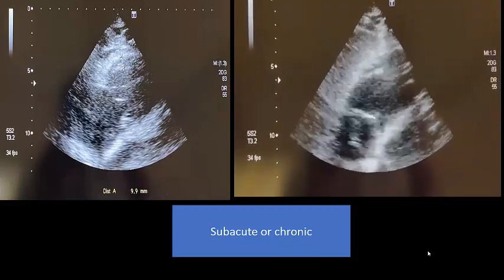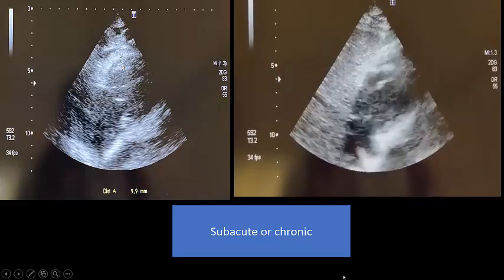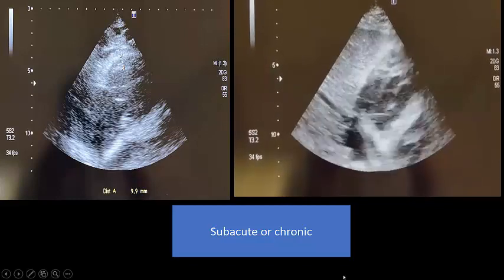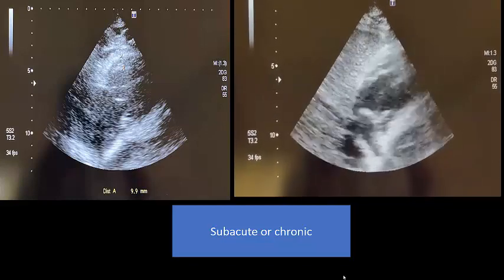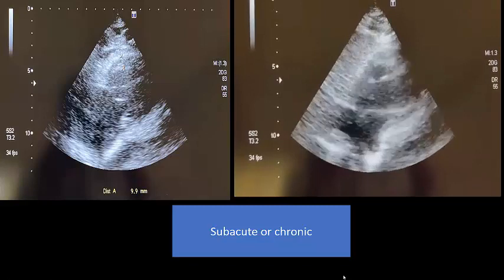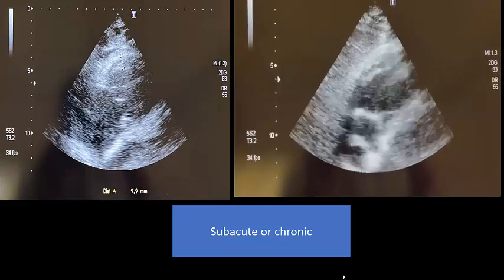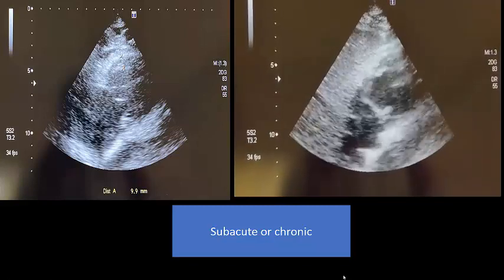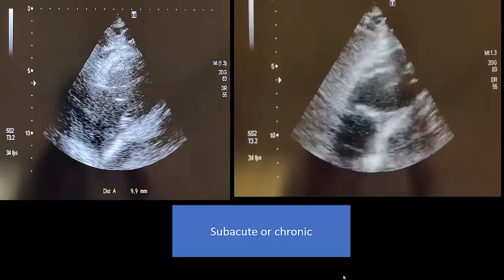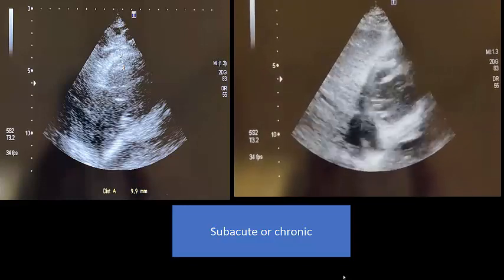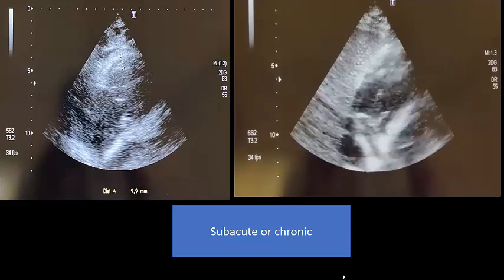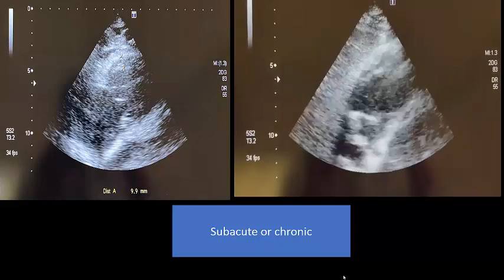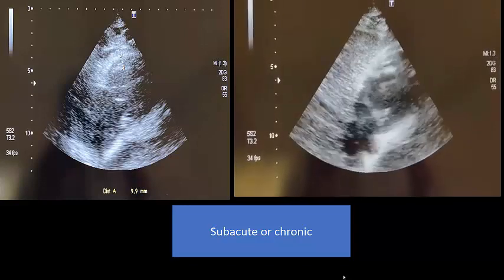This is in contrast to acute pulmonary embolism, where you would see a dilated right ventricle with right ventricular failure, very poor TAPSE, and a normal wall thickness — because in acute PE, there is no time for the wall to thicken.